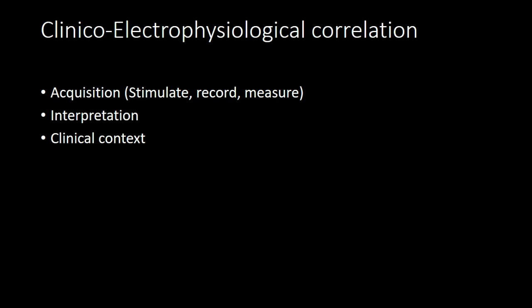After you do the acquisition of the study, the next piece is the interpretation, which I would prefer, and I know my technician team do it as well, having their own mindset or impression of what's going on in the study. But then I would like the residents and fellows to do their own interpretation when they talk to me. So that will be helpful for me to add on top of that.